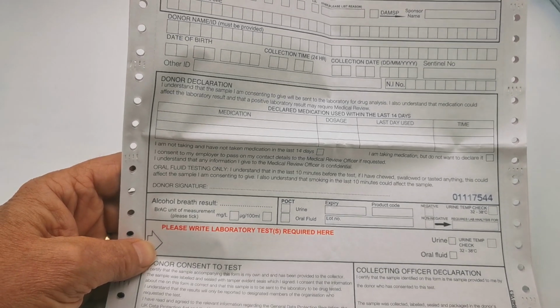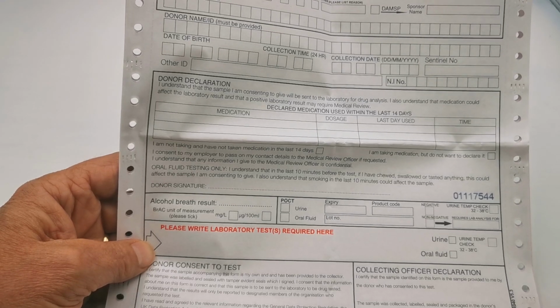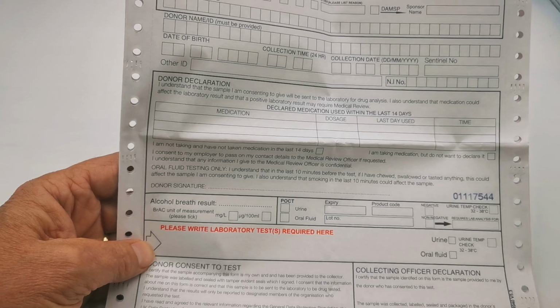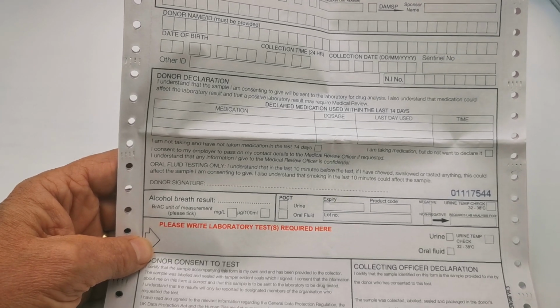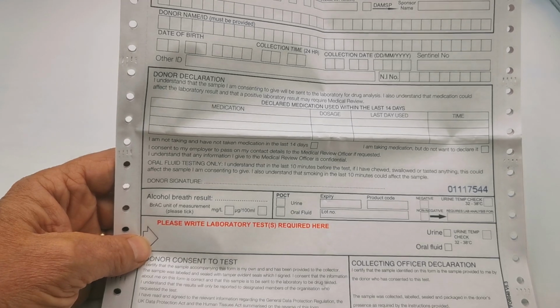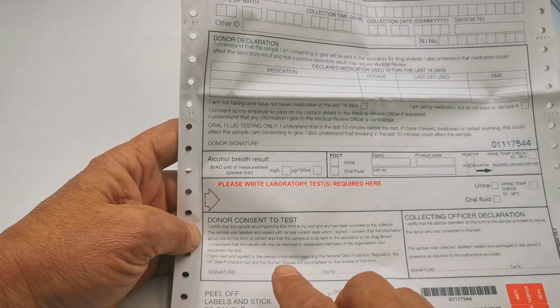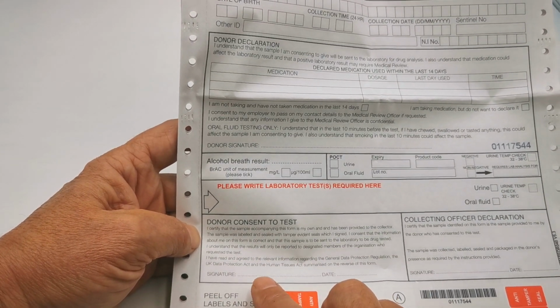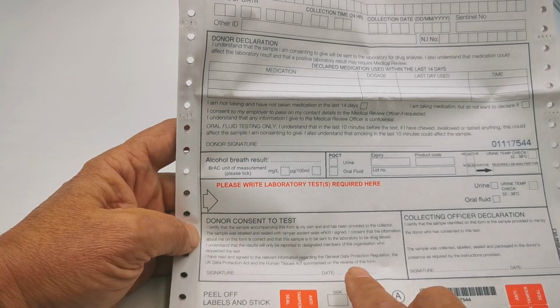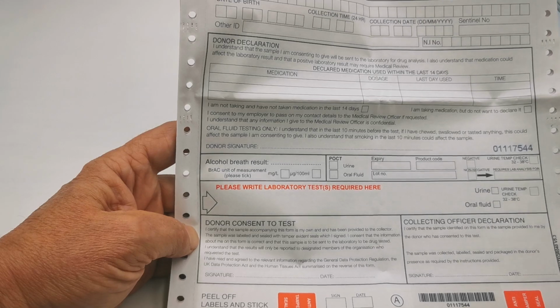If you request more than one sample to be confirmed tested, we will require a further additional payment from you to run the second confirmation test. The prepayment only includes screening for a single drug group. And then finally, in the donor consent test, even if this is the same as a collector, the signature and date must be put in both boxes for both the donor and the collector.